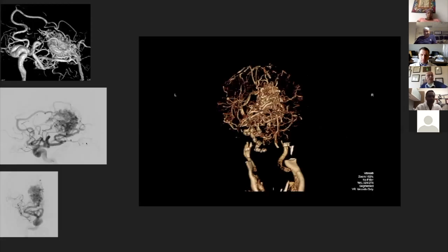Well, there's the case. There's the lateral angiogram. So when I see these, I'm thinking, what are the feeders? There are these deep feeders that come off the PCA, ACA, and I want to get these. Now, some people might say, well, let's put a catheter in. I can Onyx these very safely. That's true, you can, but I think we can do them safer at the time of surgery, dissect the arachnoid, clip these off. You have absolute control over them, and the AVM will be solved.